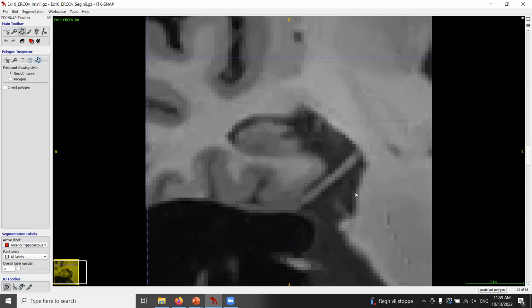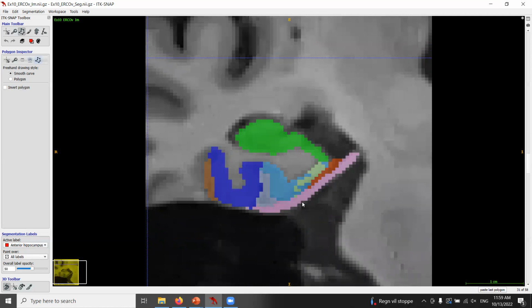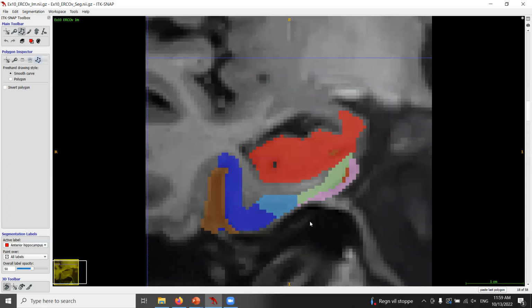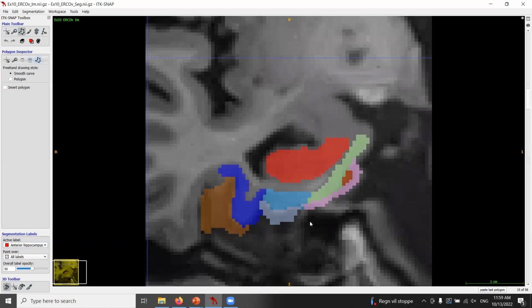So I would probably not exclude this case, although, I guess this is always the hardest type of error for me because it's really hard to determine what is really a significant error, how many slices is it. So this is definitely the one that gives me the most headaches. But yeah, I think this is good enough.